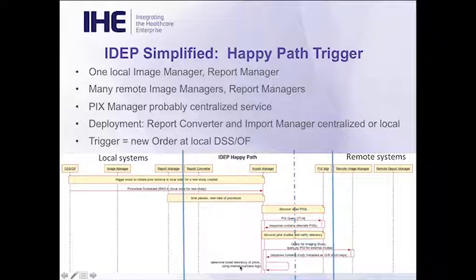Now I'm going to pause here for a second and say, as part of the concept section, we recommend that the import manager be a bit lenient, if you will, on determining what's relevant. And the local image manager may go through another set of relevancy determination as part of the hanging protocols. So it's part of our advice in the concept section to, when in doubt whether something's relevant or not, send it on to the local system, just in case they decide that it's useful.